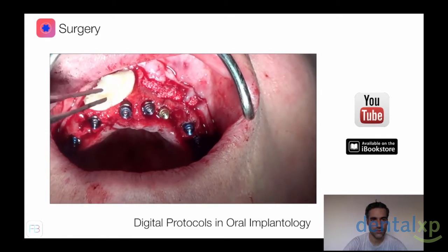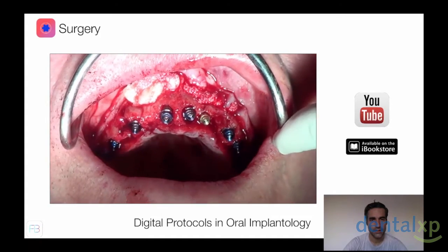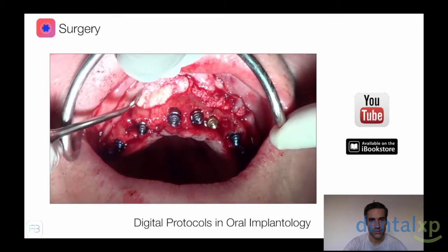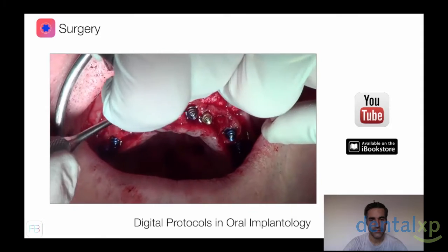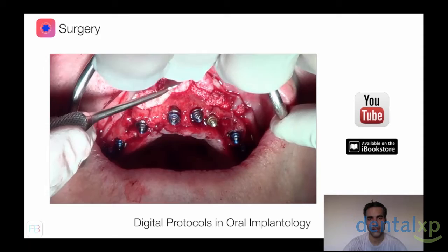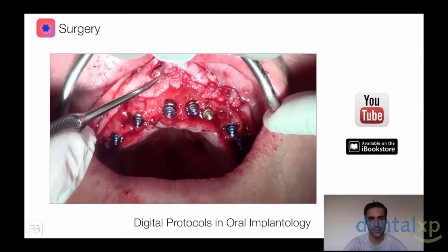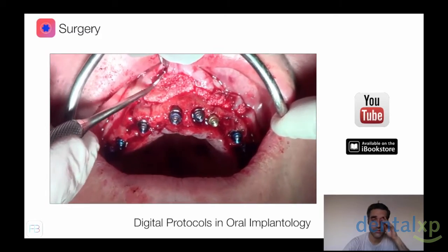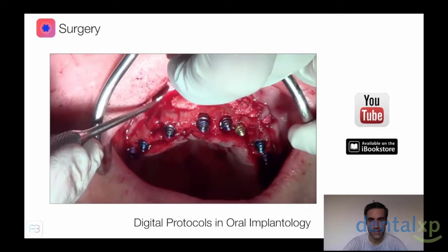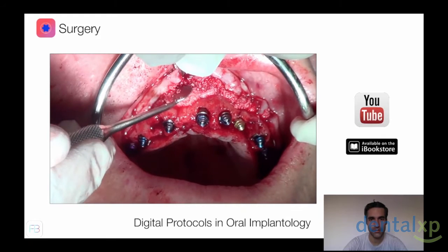This is Bio-Oss because, you know, it is a long-term turnover biomaterial that doesn't resorb so easily and takes time to resorb. So I use Bio-Oss for these cases where I place it right there, as you can see. So I enhance the lip support. You can see the entire video of the surgery on my YouTube channel, Francisco Teixeira Barbosa. You can check for my name, and you will see the entire video there.